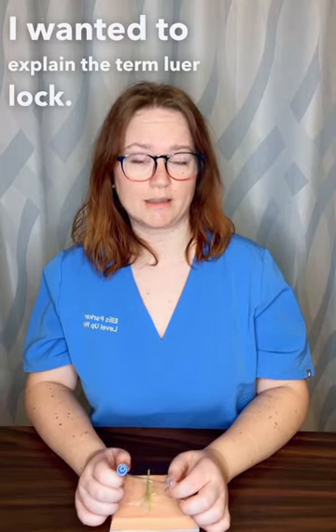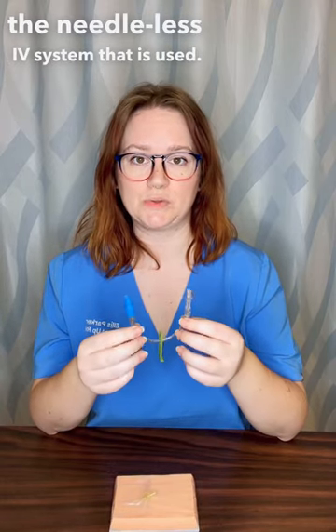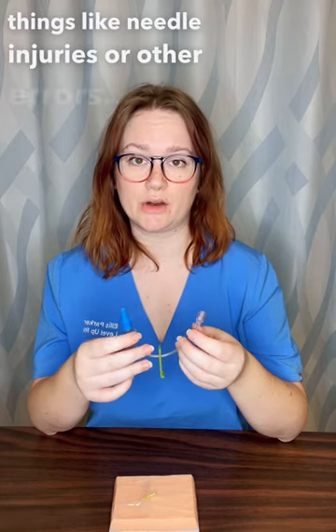I wanted to explain the term Luer-lock. Luer-lock is the term that we use to describe the needleless IV system that is used. We no longer use needles to access IV systems so that we can prevent things like needle injuries or other errors.